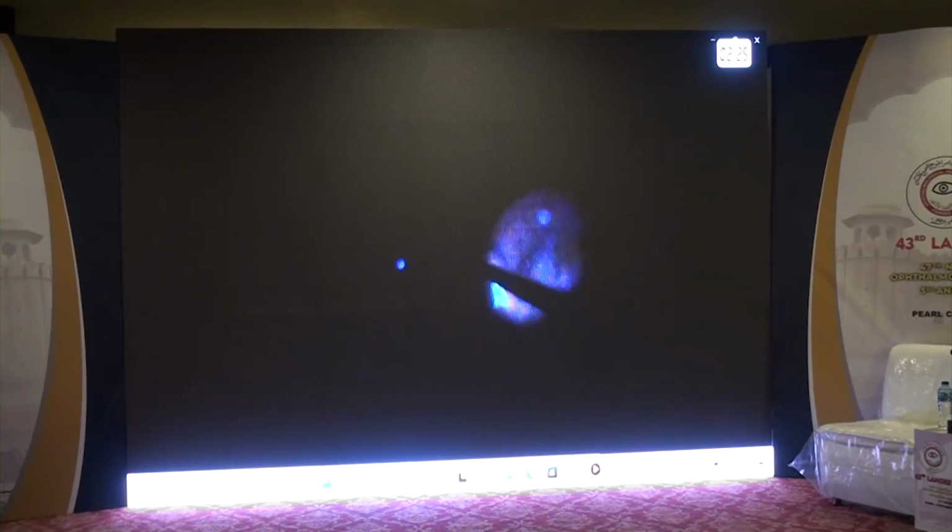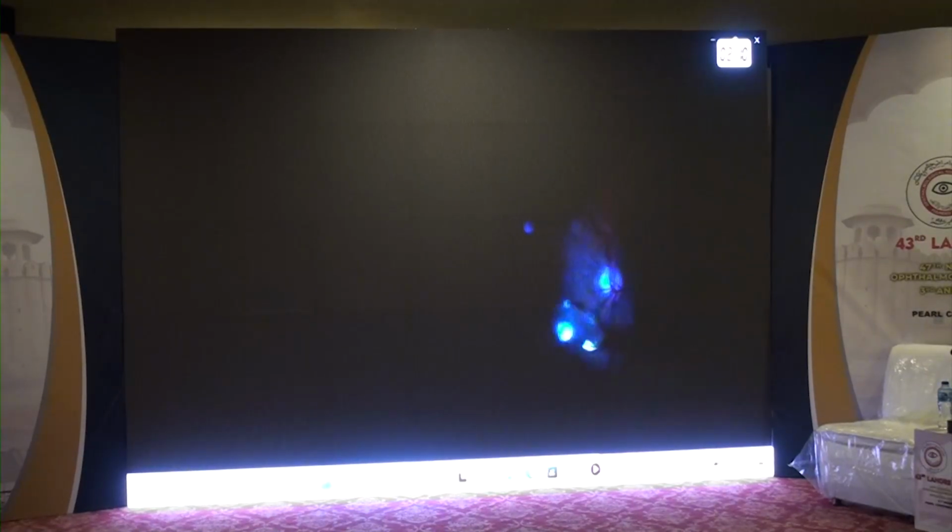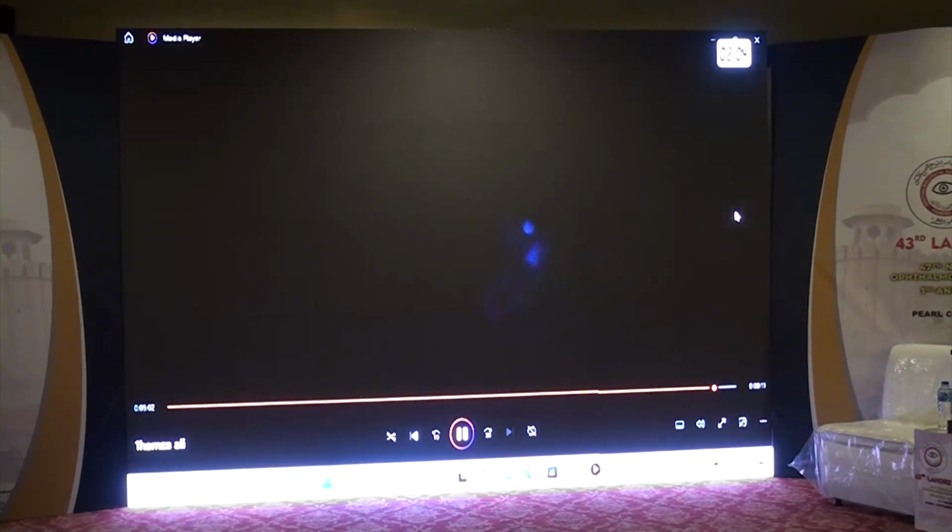So try to keep the movement of your forceps in a tangential manner following the curve of the retina. If you go straight, you will end up hitting the retina. And here I've removed it. This is the last bit. And that concludes my presentation on epiretinal membrane and ILM peeling.